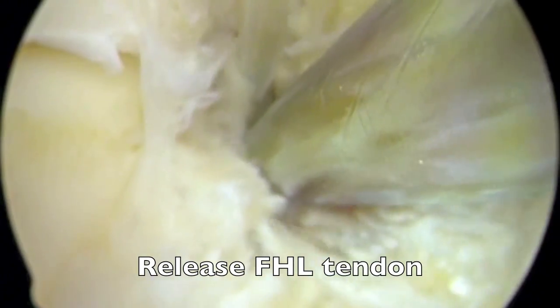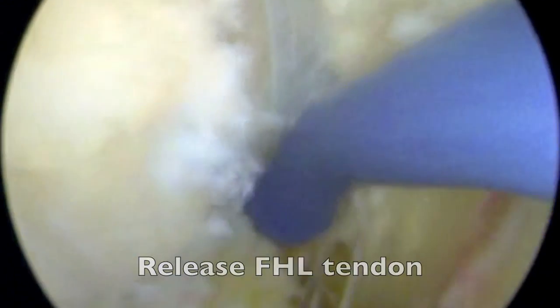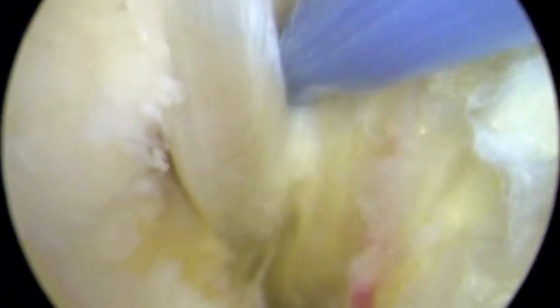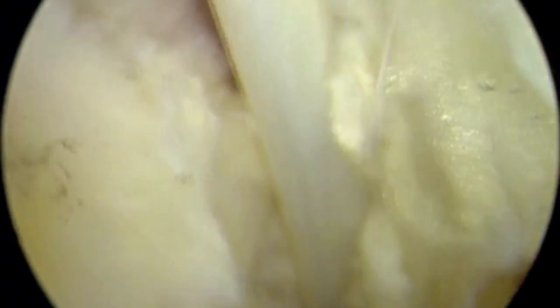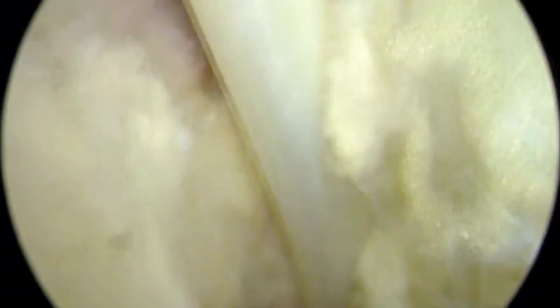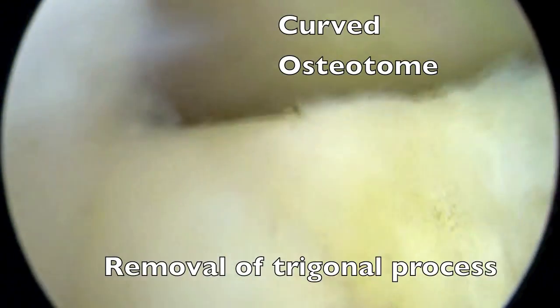Then a sharp curved osteotome, or bone cutting instrument, is introduced to cut the talus bone. The fragment of extra bone is then removed. This extra bone can result from an abnormal extension of the talus bone itself, from a fracture, or from a piece of bone which never normally fused in development, called an os trigonum.